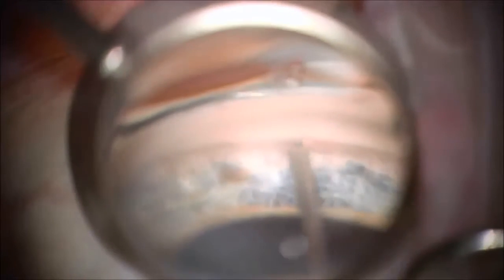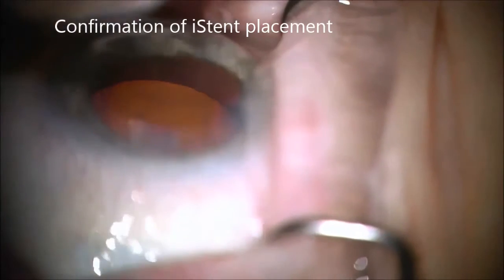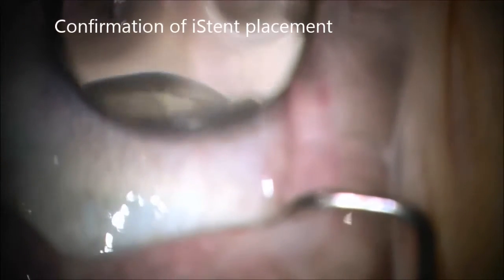After proper positioning is achieved, the iStent is then released and tapped into place to ensure proper placement.